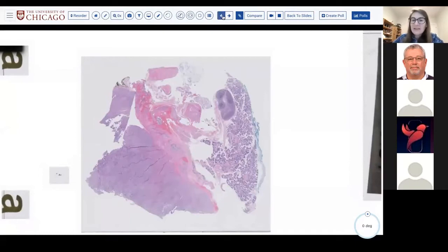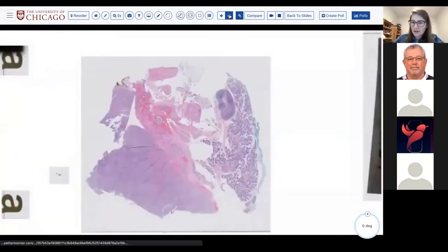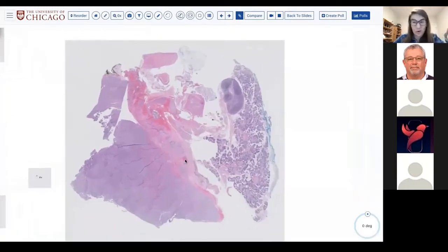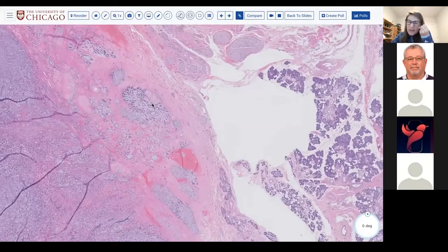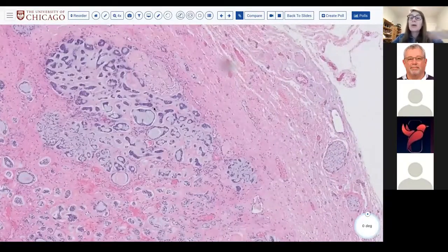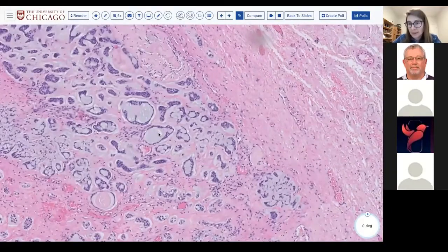And so this is an adenoid cystic that has a biphasic architecture that could certainly mimic a pleomorphic adenoma on biopsy with that biphasic phenotype with the myxoid stroma. But I think some of you got a sense, right, that there was maybe a little more cribriform architecture, that maybe the nuclei were a little bit more wrinkled like you tend to see in adenoid cystic. Exactly. And so at least raising the possibility of adenoid cystic on core biopsy would be useful clinically.